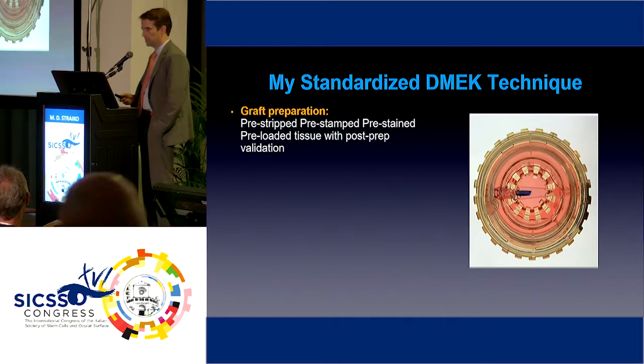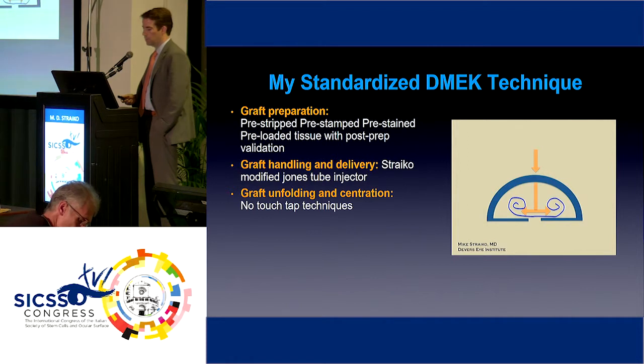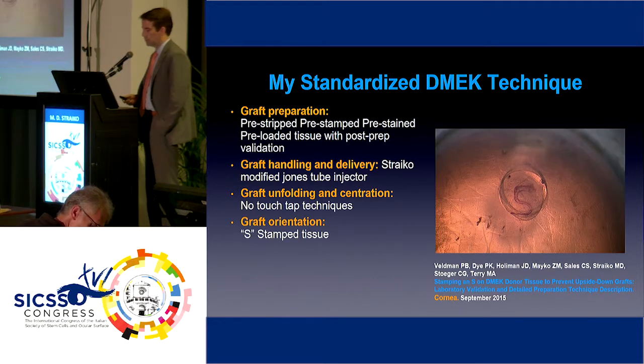Graft preparation is now done at the eye bank with pre-stripped, pre-stamped, pre-stained, pre-loaded tissue that they do post-preparation validation on to make sure the endothelium is still healthy after it's been pre-loaded. Graft handling and delivery are done with the STRAIKO modified Jones tube injector. Graft unfolding and centration, I use no-touch tap techniques. Graft orientation is confirmed with S-stamped tissue.